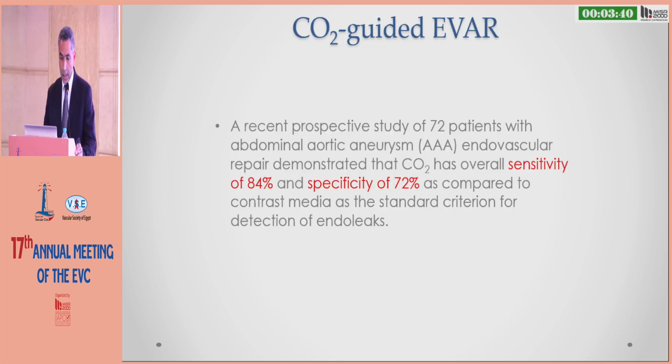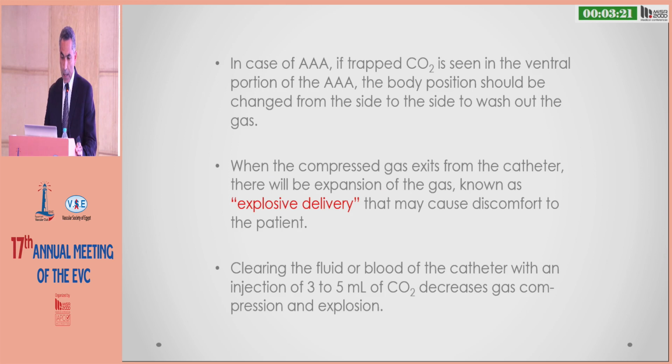CO2 guided EVAR has recently been described in a prospective study of 72 patients with abdominal aortic aneurysm, which demonstrated that CO2 has an overall sensitivity of 84% and specificity of 72% as compared to contrast agent for detection of endoleaks. And if CO2 is trapped in the ventral portion of the AAA, the body position should be changed from side to side to wash out the gas.